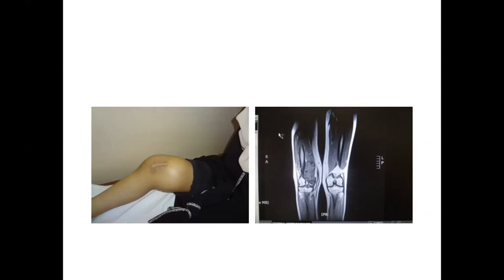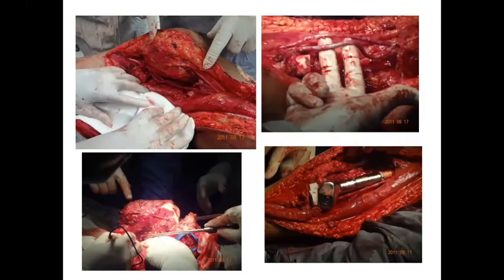In these patients, frequently they're invading into vessels, either popliteal or femoral vessels, and I usually do the bypasses first, leave them a bit long, so patients will not get ischemic during the excision, do the excision, and if I need to shorten bypasses, that's what I do. This is one example of such cases. I've done both the arterial and the venous anastomosis or bypasses, then went in to remove the tumor. As you can see, they're a bit long, and that's intentional. Once you put in the knee joint, then you measure it up. If they don't sit appropriately, then you can always shorten one of your bypasses with a simple primary anastomosis.